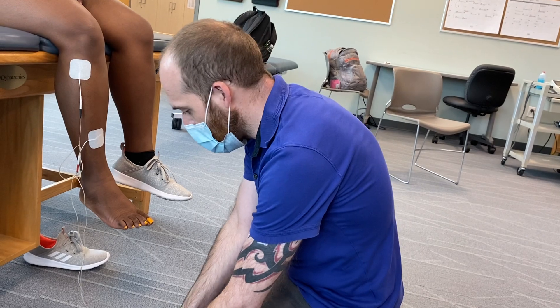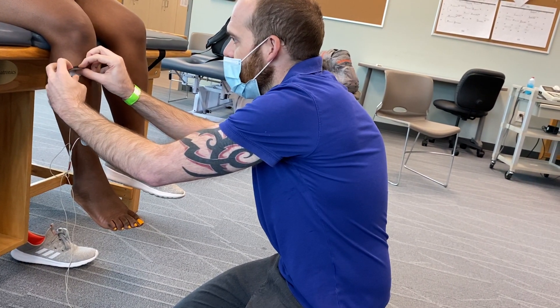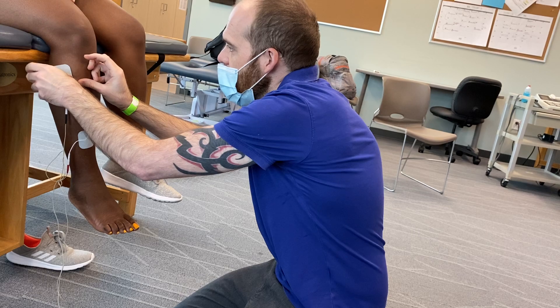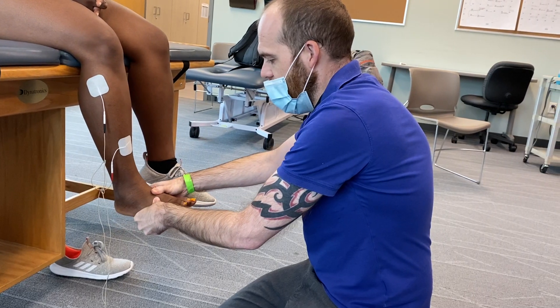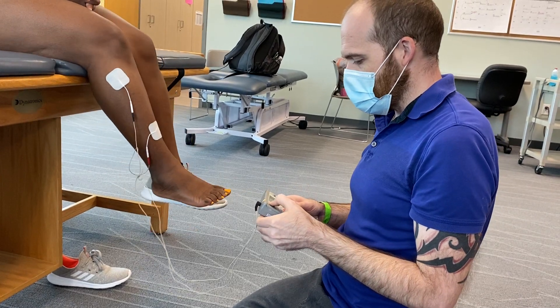I'm going to try one more thing to get it perfect. I'll take this top electrode and move it over just a little bit laterally to see if I can get pure dorsiflexion without any inversion.